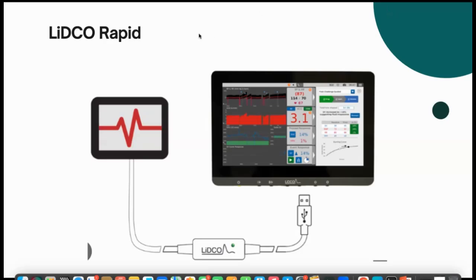LIDCO rapid means we don't use lithium dilution techniques. It is by the arterial waveform analysis that we are deriving these numbers. Again, you can see the Starling curve and how the volume response is happening. When you give volume, you can see the numbers rising and also dropping. There are a lot of numbers coming up here. You can see the volume response, the preload response and all that.